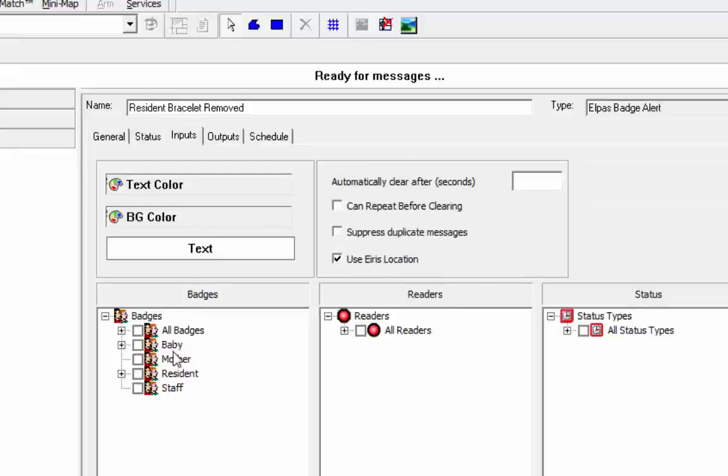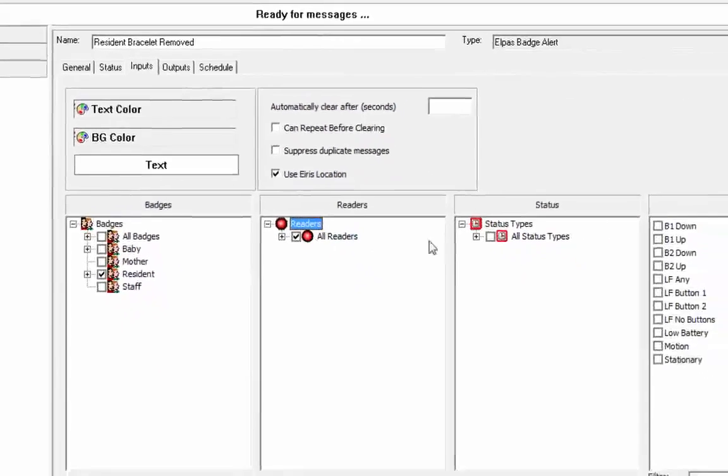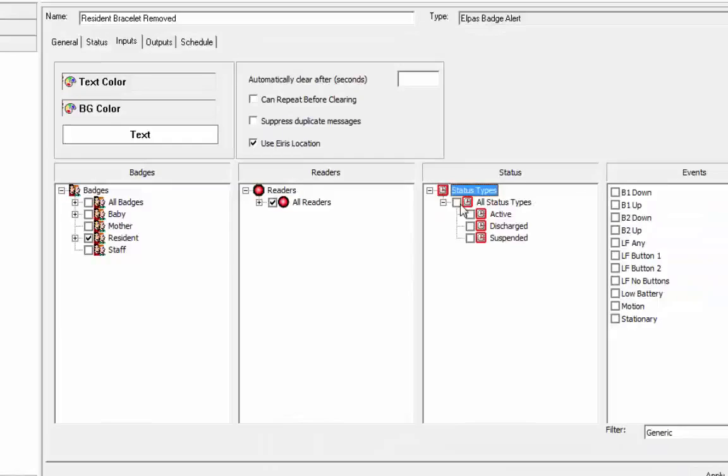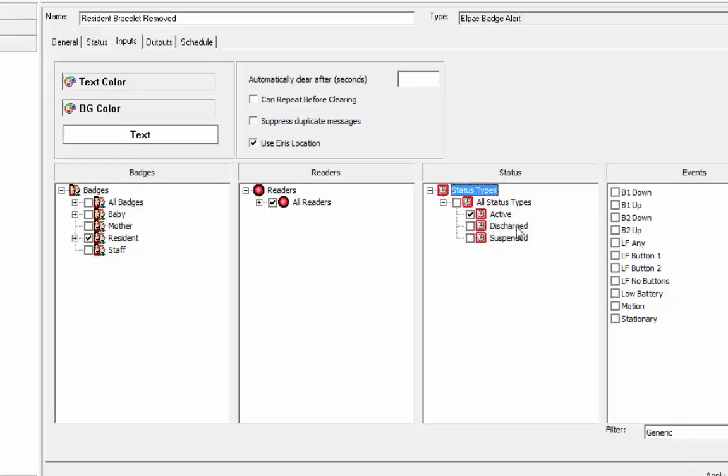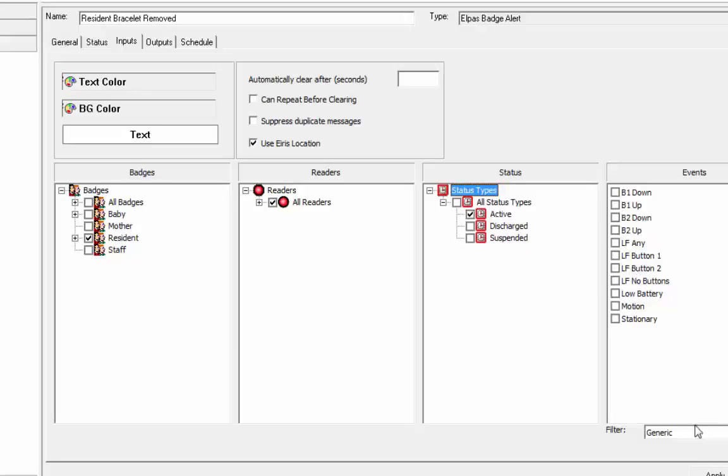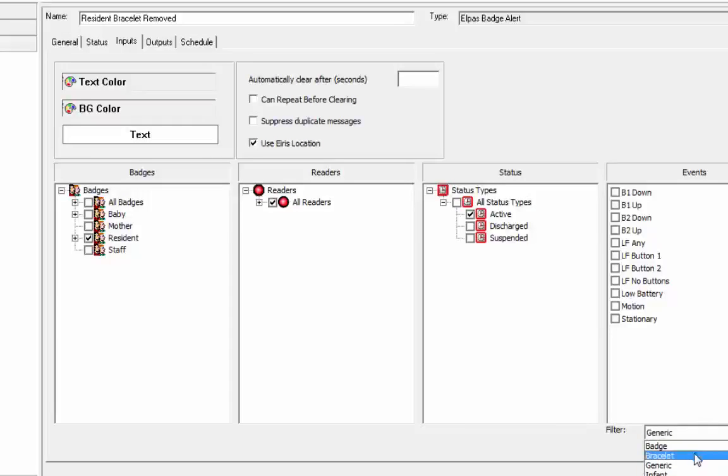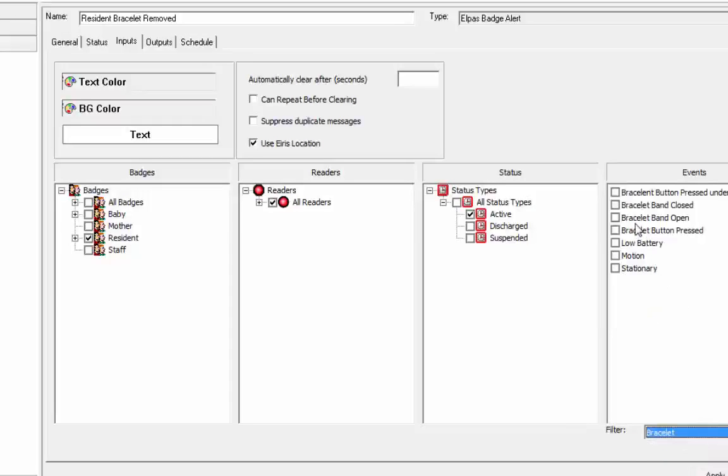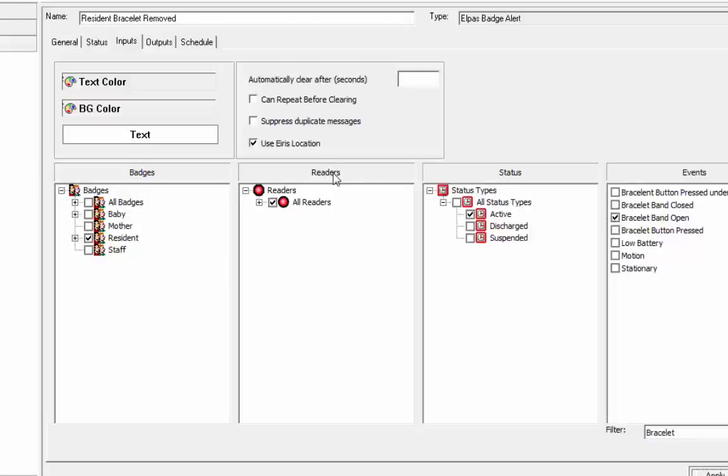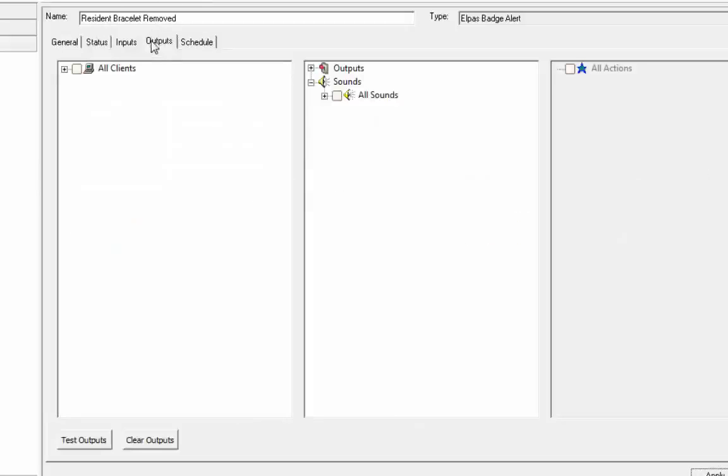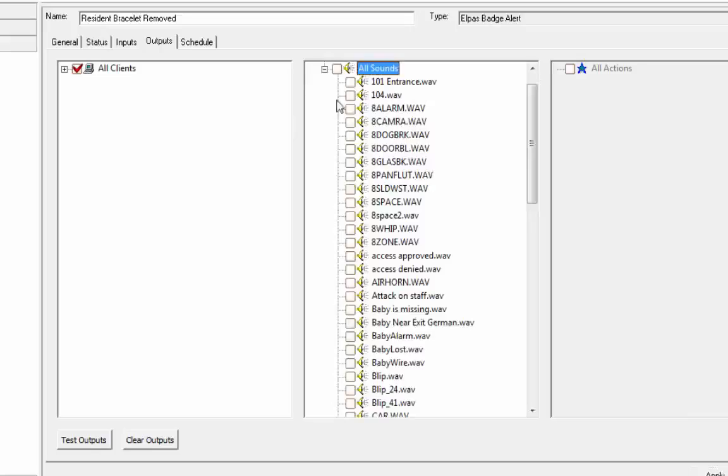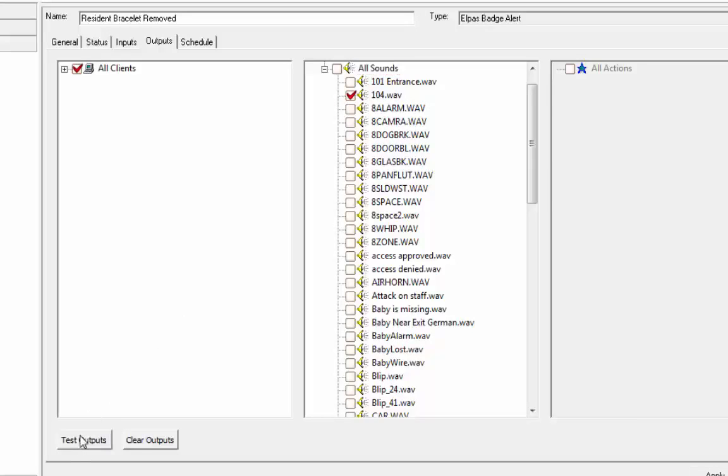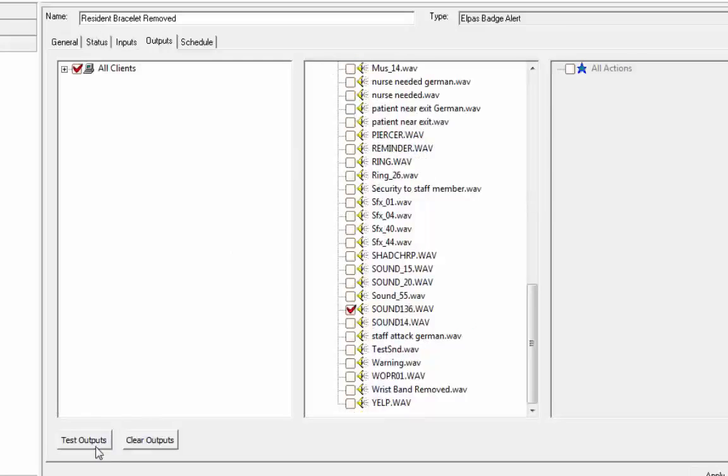Let's go to the inputs. Outputs. So now we're doing the residents. All readers. Status. Say all status. No. Not suspended. They're just in the active state. And we're going to go to, in this case, a bracelet. And the bracelet band open. Outputs all clients. And we're going to do, let's say, let's put this 104 wave. Let's test that. Oh, something a little better than that. That's good.